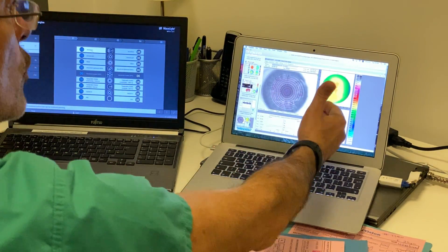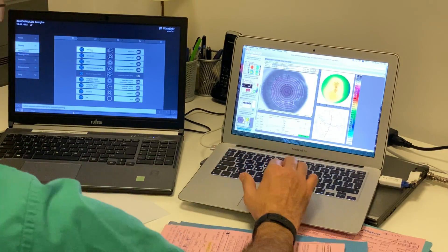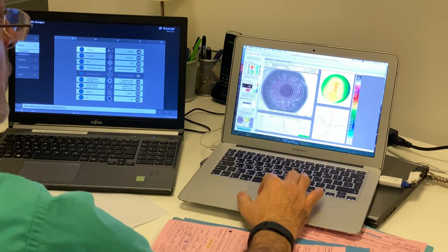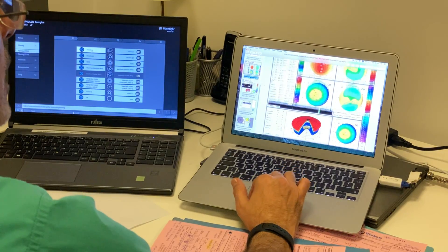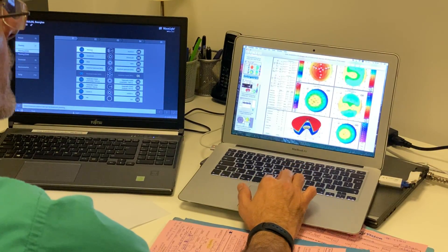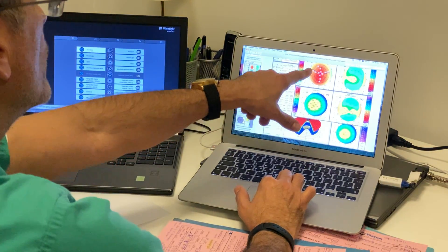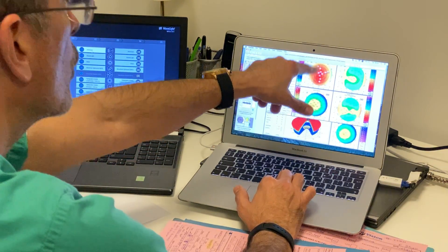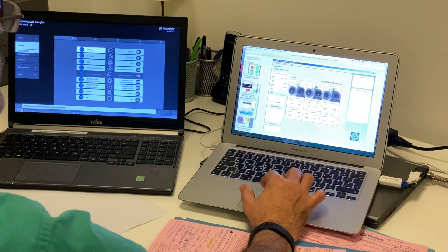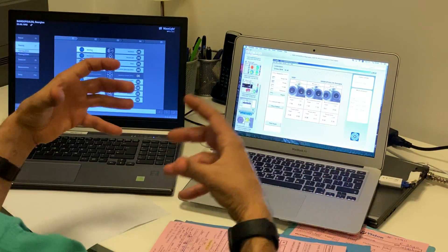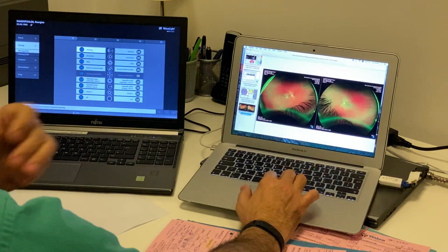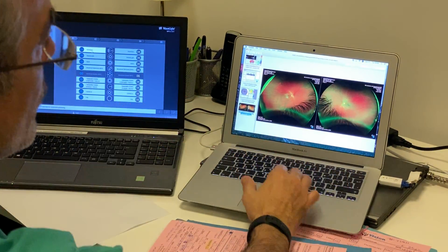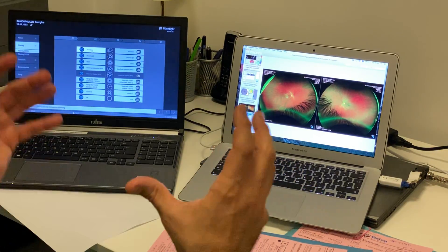Then confirming the topographic measurements we're seeing here, which show higher astigmatic power, about one diopter with the rule instead of the half diopter the patient chose. Here are the tomographic confirmation of this astigmatism again, more than half diopter tomographic total astigmatism on that cornea, pupillometry to look at the pupillary size and adjust the ablation diameter, and of course, nothing to do with the laser, but a confirmation that the fundus is normal.